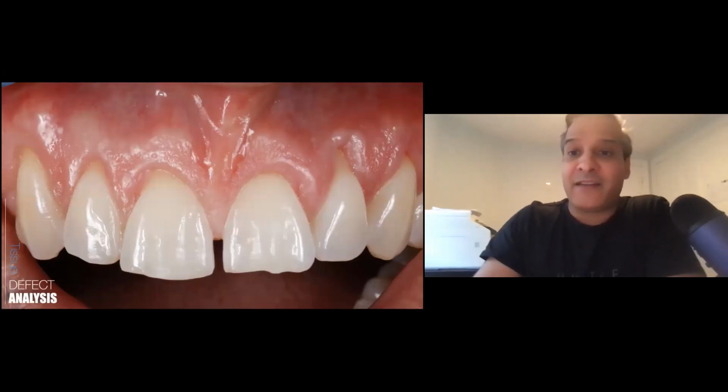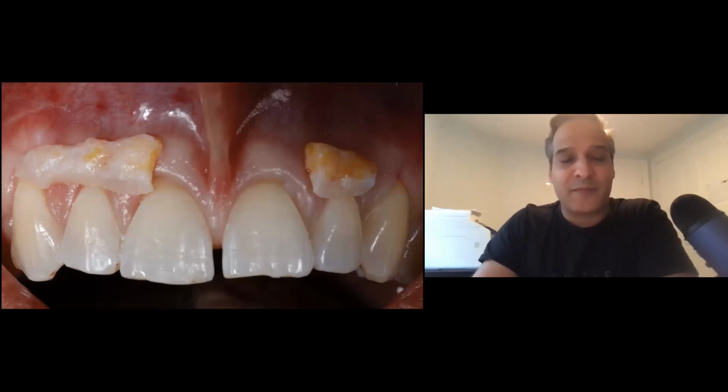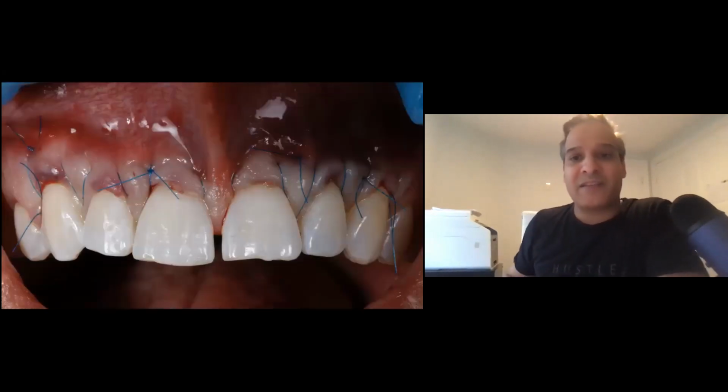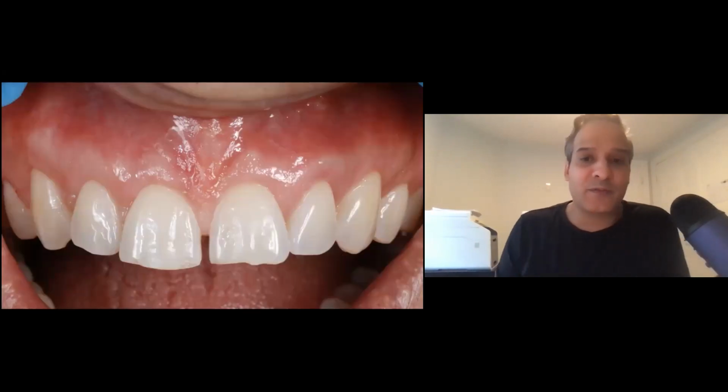Same case here, again, an aesthetic area. You can see, look at the canine, the 1-3, the 1-2, a little bit on the 1-1, and especially the 2-2 and the 2-3. So the 2-2 is the main one that looks bad. So we took some graft material, cut it in half, measured both sides, placed them into the site, sling sutures again. And this is the post-op.